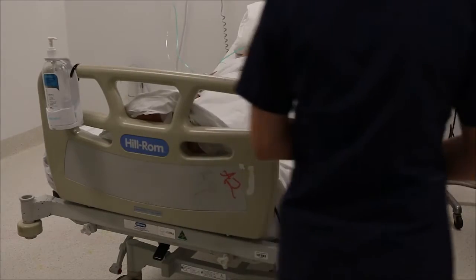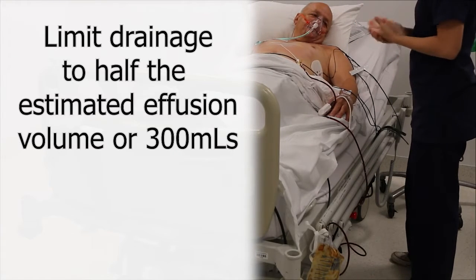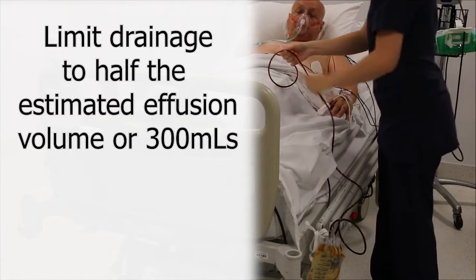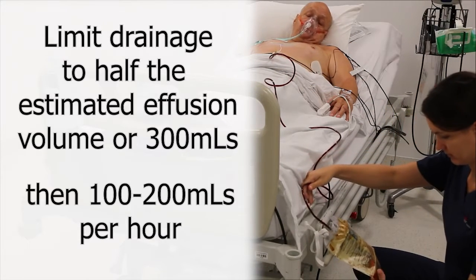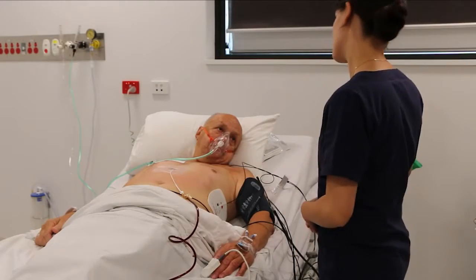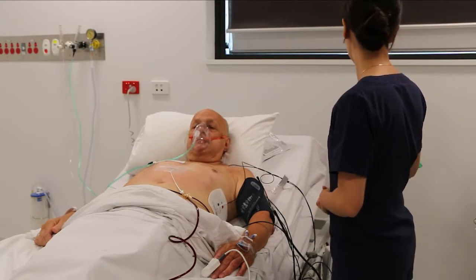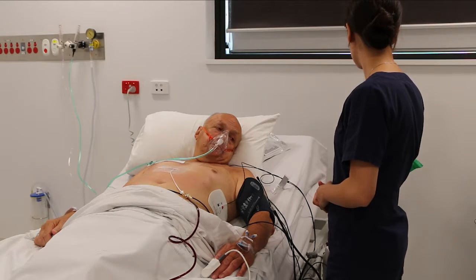As a general rule, the medical officer may advise to limit initial drainage to half the estimated effusion volume, or 300 millilitres, whichever is less, to avoid rebound right-sided failure, then 100 to 200 millilitres per hour for the following hours. Continue to monitor the patient's vital signs post-procedure, decreasing the frequency as the patient's condition stabilises.